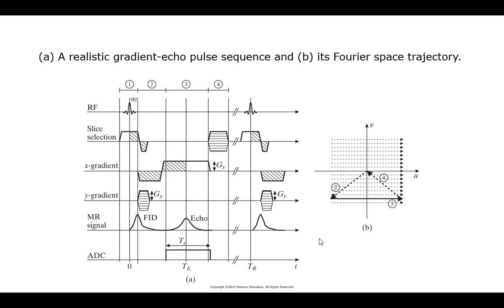I have a quick question. Sure. You mentioned that if we don't go back to the original state, it'll mess up our next measurement. Yeah, because you're starting here or some decayed version, right? Makes sense. Is there any merit to having a more complicated algorithm to save some time and just start there and move back? So, yes, there can be, right? The question is, do you know exactly how much it's decayed? That's true. The neat thing about this one, you don't need to know where you are because it's pulling everything to the origin.